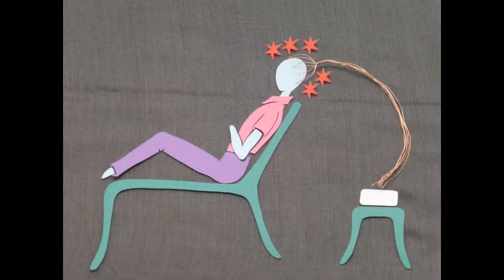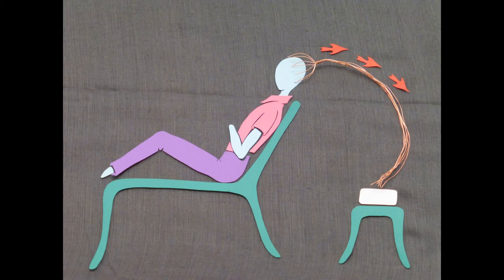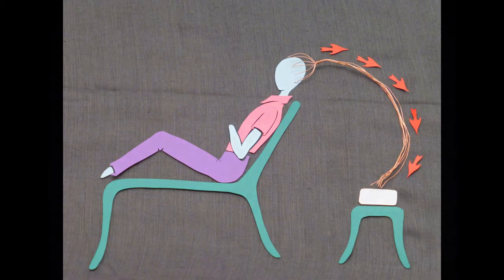So if we can capture a seizure during an EEG, then of course that would clinch the diagnosis. We'd be absolutely clear about what's going on. We'd often be very clear about what type of epilepsy it is and what part of the brain it arises from. But of course it would be very unusual to catch a seizure. You know, an EEG lasts an hour or so, a routine recording. And people's seizures typically seem to happen fairly randomly. So it's a very hit and miss thing whether you would catch a seizure during a routine EEG.